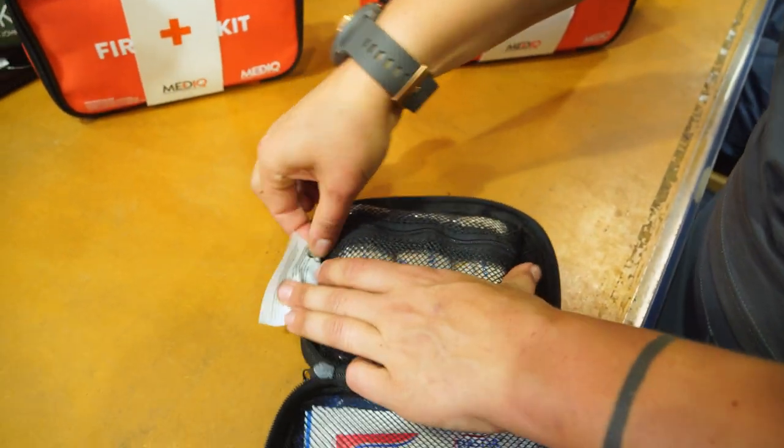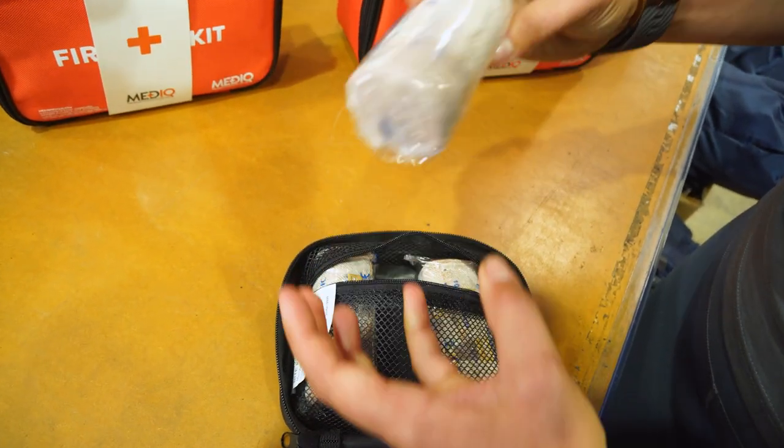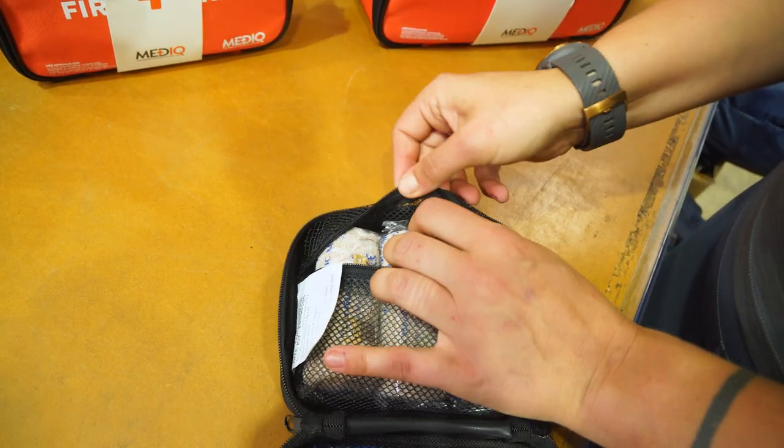And over here, we've got three firm elastic compression bandages for bandaging up the leg or the arm or the site of the bite.